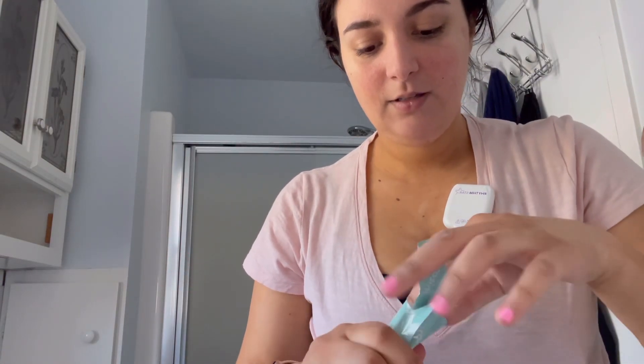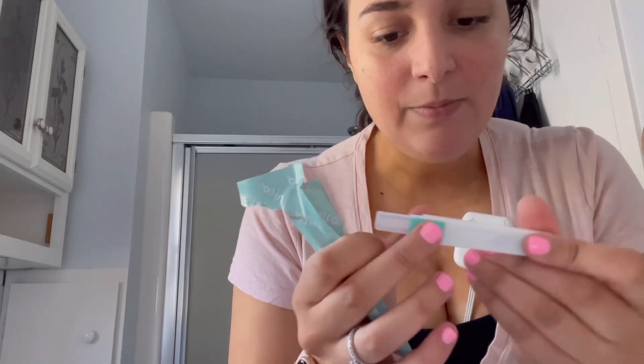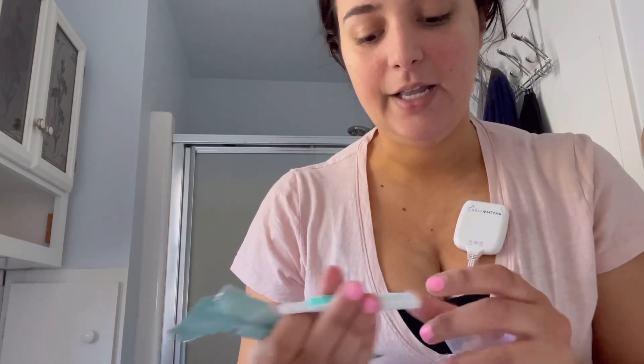We have the monitor, which when I take off my phone case it attaches to the back, and you're gonna put the strips in the side of it. The box comes with 15 of these strips. This is what the strip looks like. It comes with a cup so you can dip your pee into that and then you put the strip in there for 15 seconds.